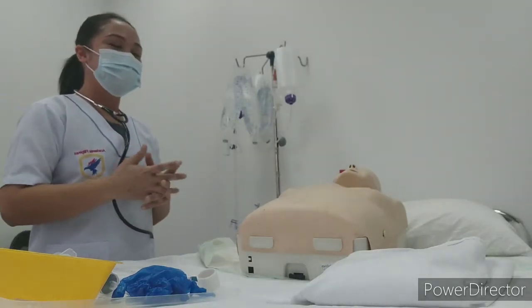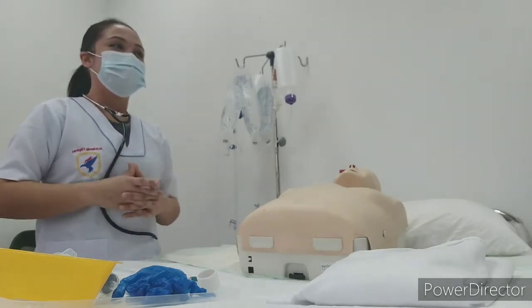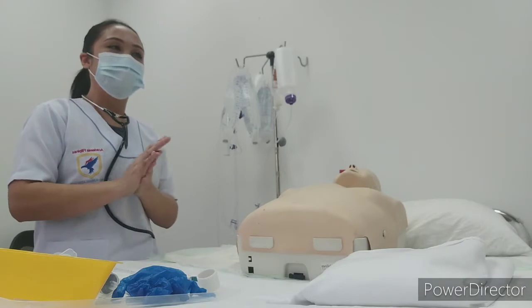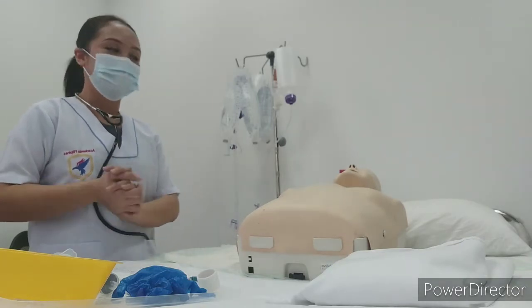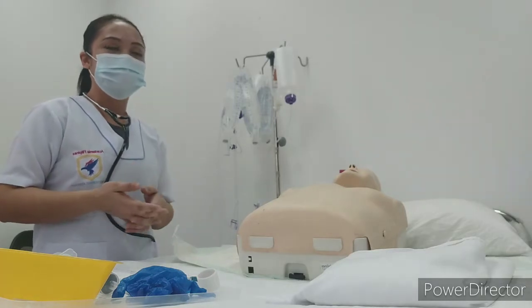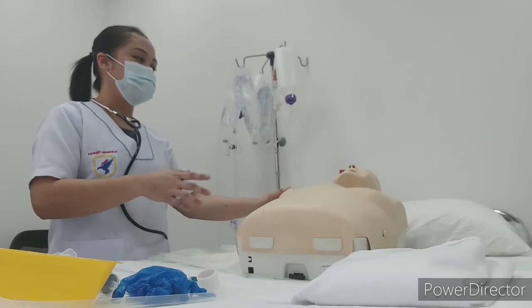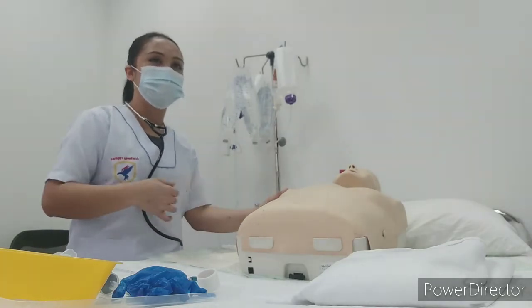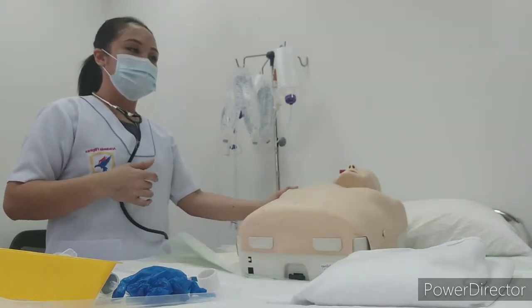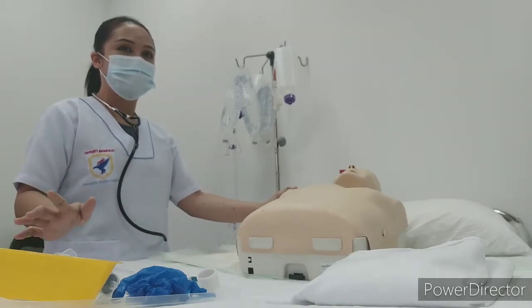Okay, so before we do the procedure, there is a universal protocol. The first one is hand sanitize, hand wash and then sanitize. The second one, introduce yourself to the patient. And then explain the procedure to the patient, that you are going to do feeding to the patient. The next one, check also this equipment if it's working.